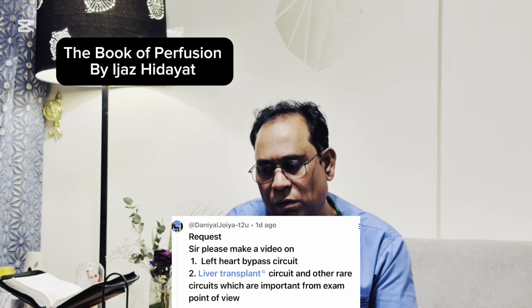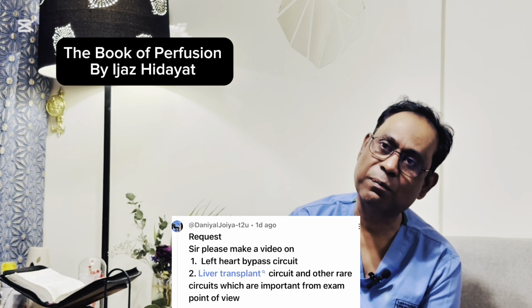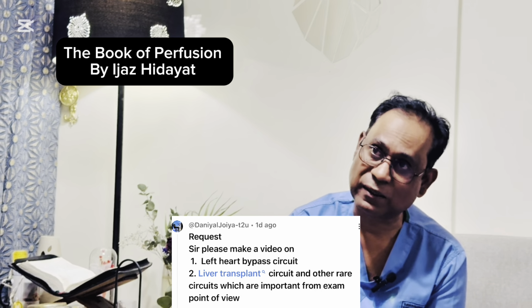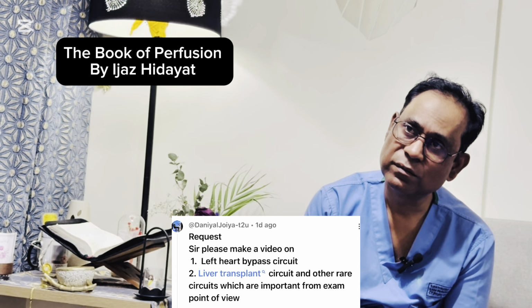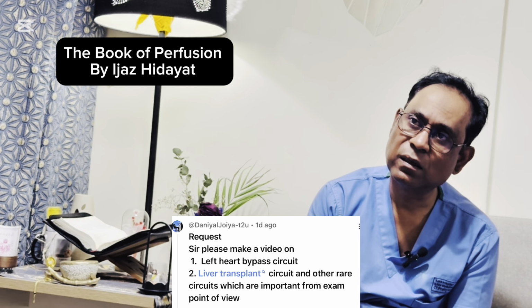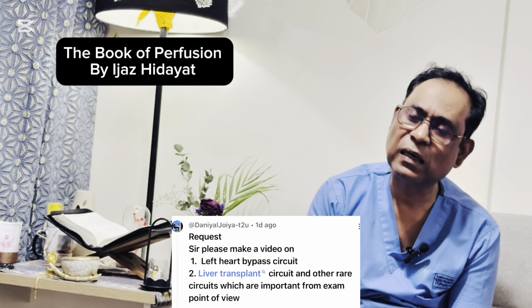Sometimes we use ECMO flow. ECMO flow can help as a left heart bypass. Sorry to interrupt you, sir. Can you please tell the viewers the full form, because some of them are not from a medical background? What is ECMO? ECMO is extracorporeal membrane oxygenation, but here we don't need an ECMO oxygenator.